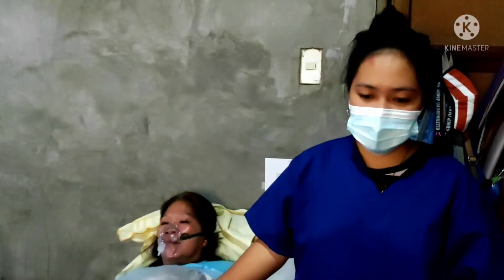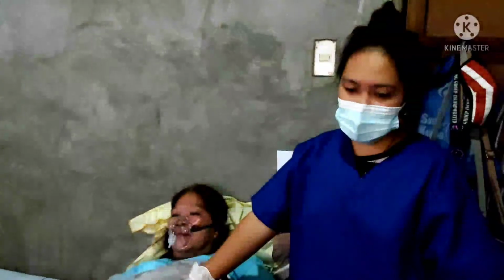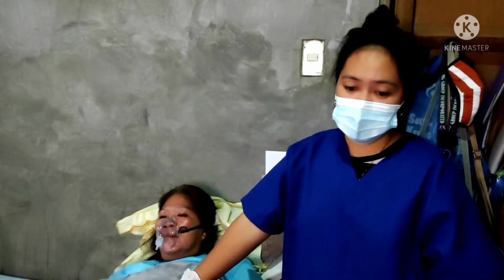After that, repeat the suctioning procedure, but don't perform more than the maximum number of passes. Watch for any alteration in the patient's cardiopulmonary status. When possible, allow adequate time, at least 1 minute between suction passes, to allow for ventilation and oxygenation. Rinse the catheter and connecting tubing by suctioning normal saline until the catheter and tubing have been cleaned of secretions.